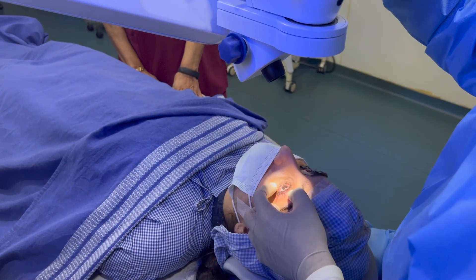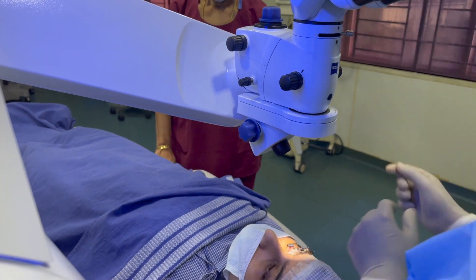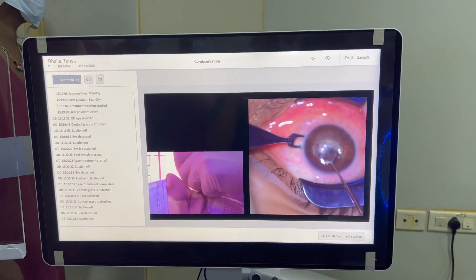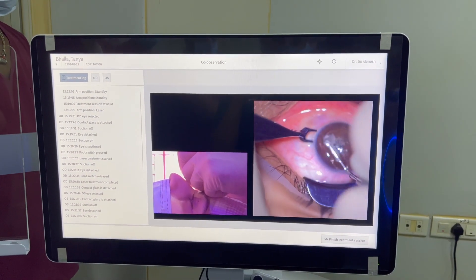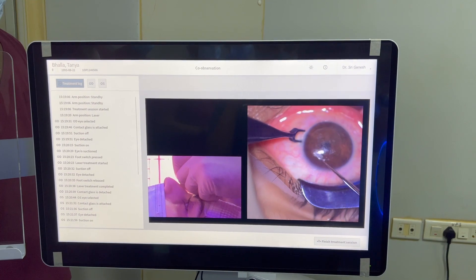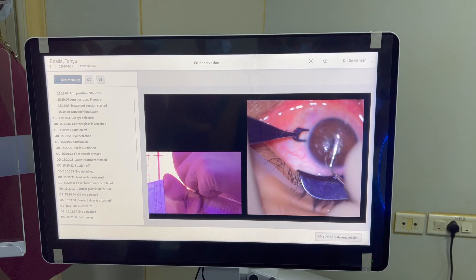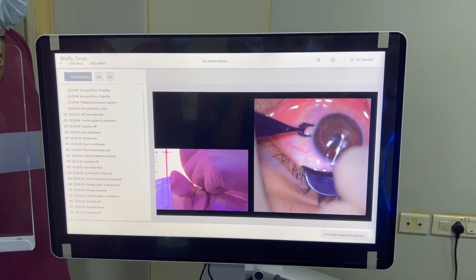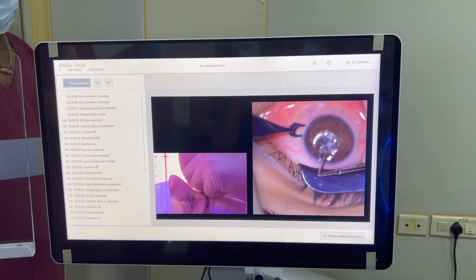Once the left eye lenticule is extracted, I move the microscope over to the right eye and do the lenticule extraction for the right eye. This saves a lot of time because you don't need to keep bringing the laser and microscope arms up and down. I'm able to treat about 10 patients — 20 eyes — in one hour, compared to the Visamax 500 where I could treat about six patients per hour. This improves the efficiency of the workflow and patient turnaround.